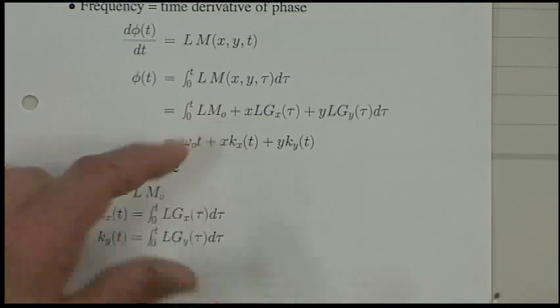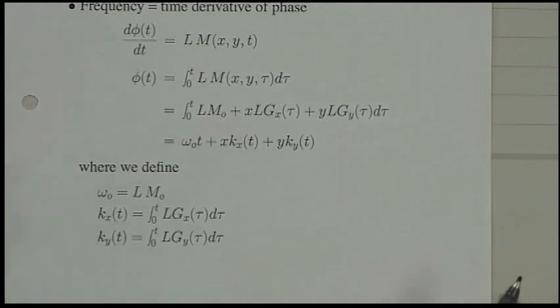But that's already been accounted for. It's actually a good point. When you actually demodulate the signal in the hardware, you have to demodulate not with omega 0, but with a slightly offset frequency. But you knew that offset frequency because you transmitted with the same offset frequency. So, yeah, it's a detail that has to be taken into account in hardware.